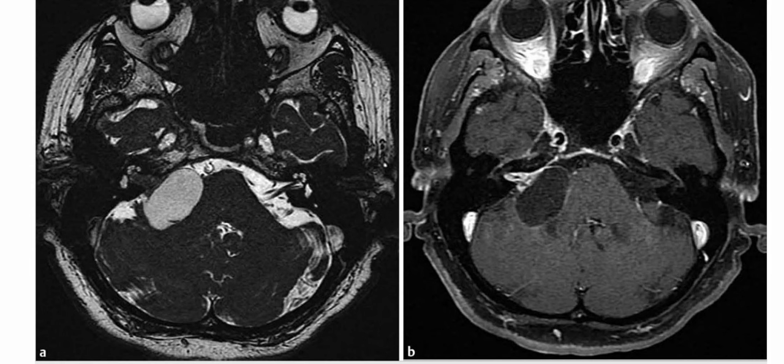These are images of a 32-year-old man presenting with sensorineural hearing loss. On the high-resolution axial FIESTA sequence, there is a cystic mass in the right cerebellopontine angle with soft tissue signal within the right internal auditory canal. The post-contrast axial T1-weighted fat-suppressed MRI shows avid enhancement of the solid component within the internal auditory canal extending through the porus acousticus. The key finding is a cerebellopontine angle mass and the diagnosis is vestibular schwannoma. In the differentials, you can add arachnoid cyst, meningioma, epidermoid cyst, and lipoma.